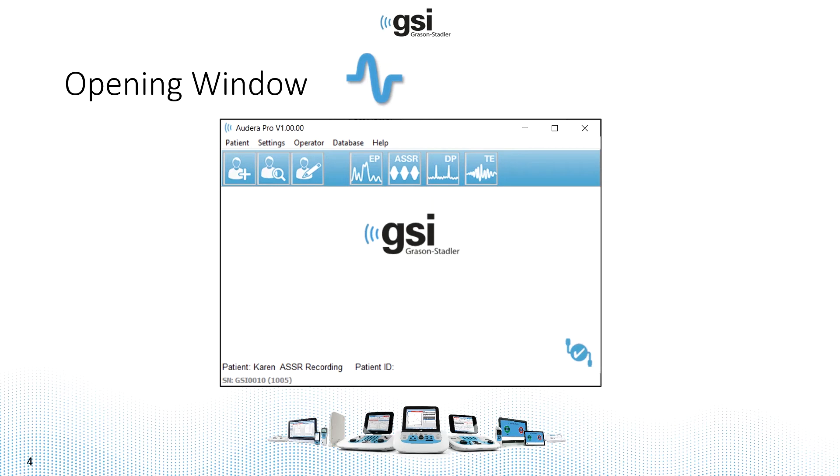When you launch the Adera Pro software, you're always going to open up to this window. We call it the opening window. In the lower right corner, a check mark indicates that you're ready to test. The computer is communicating with the Adera Pro device.